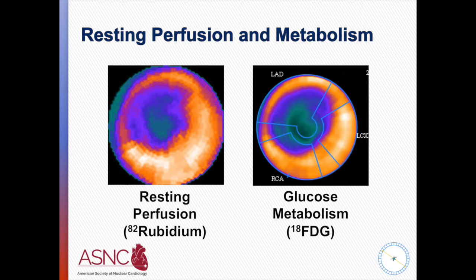So how did this study help you in the case of this particular patient? Well, this type of result would imply that the patient should be referred for other treatments, medical therapy for the ischemic cardiomyopathy, possibly defibrillator therapy if the ejection fraction remains below the threshold of 35% after medical therapy.